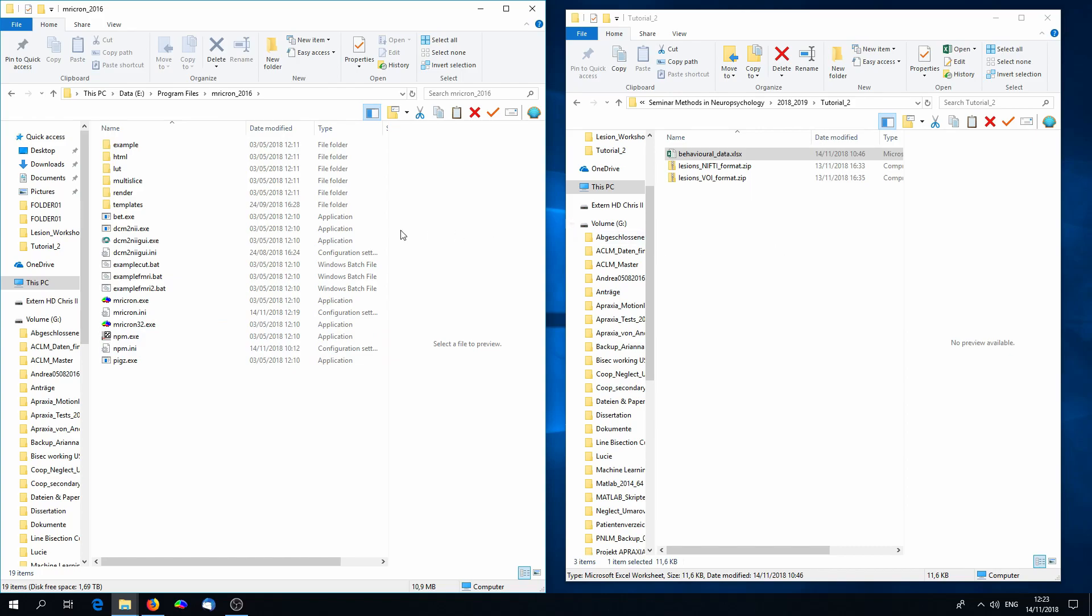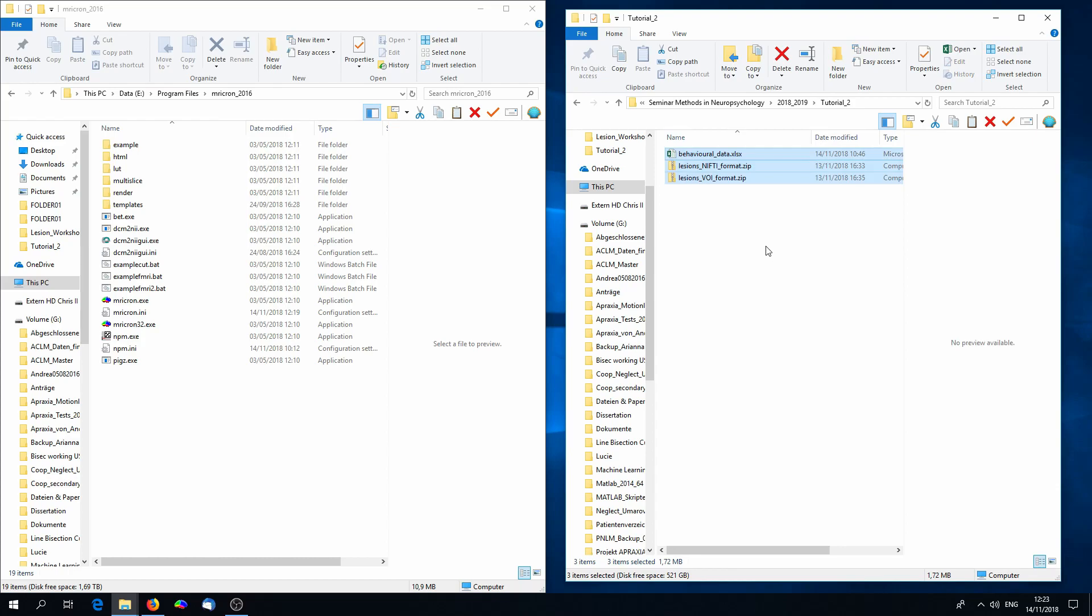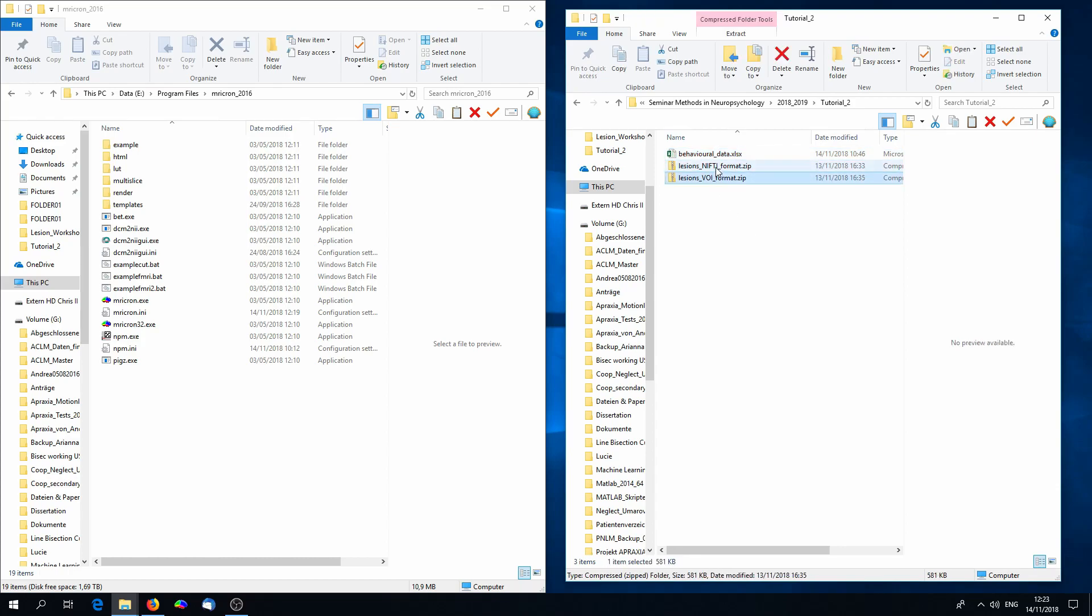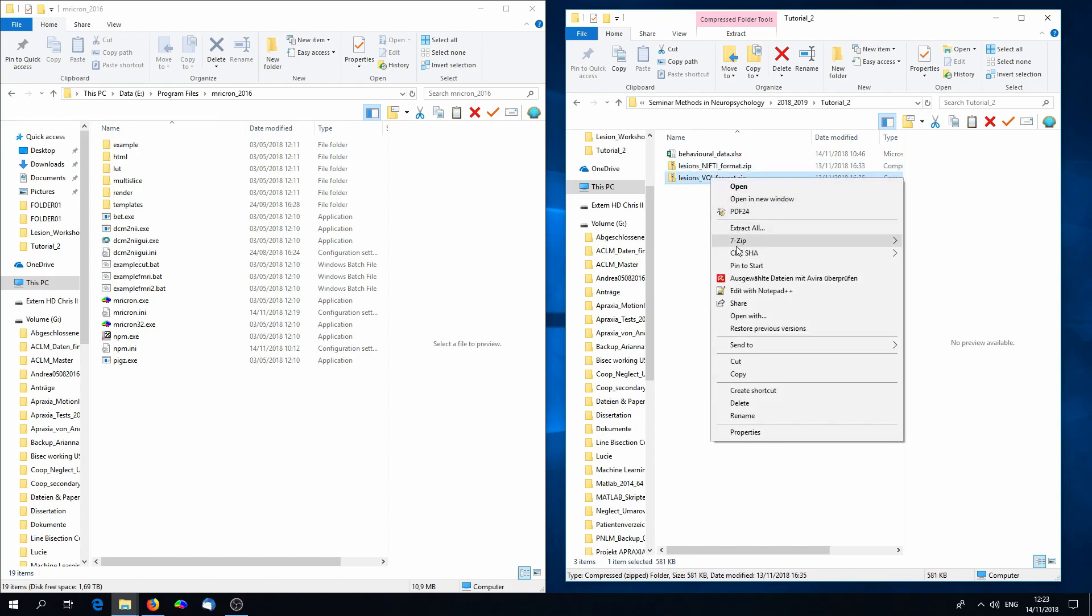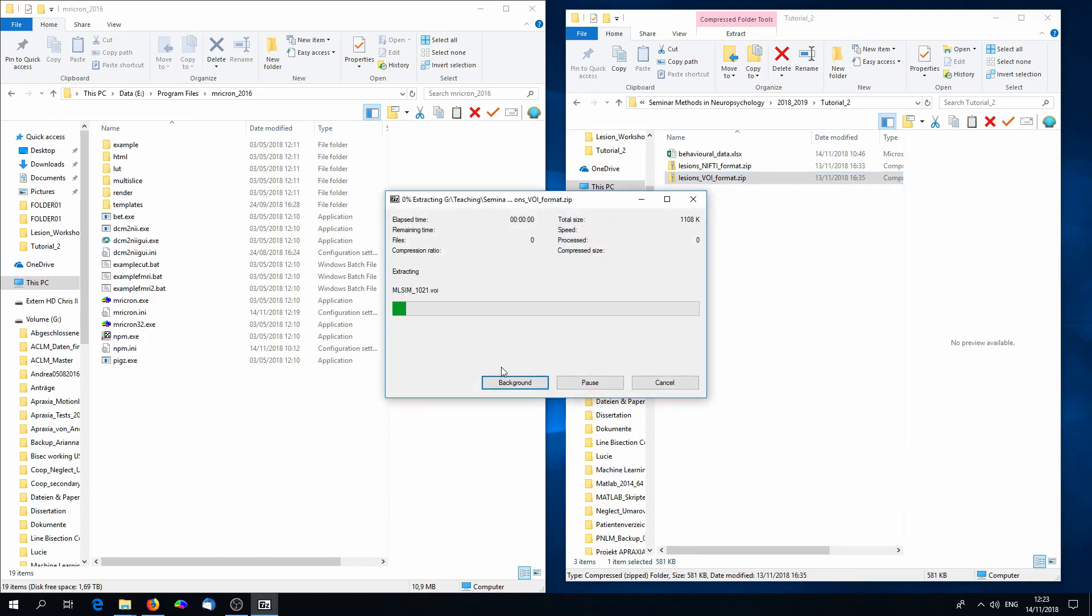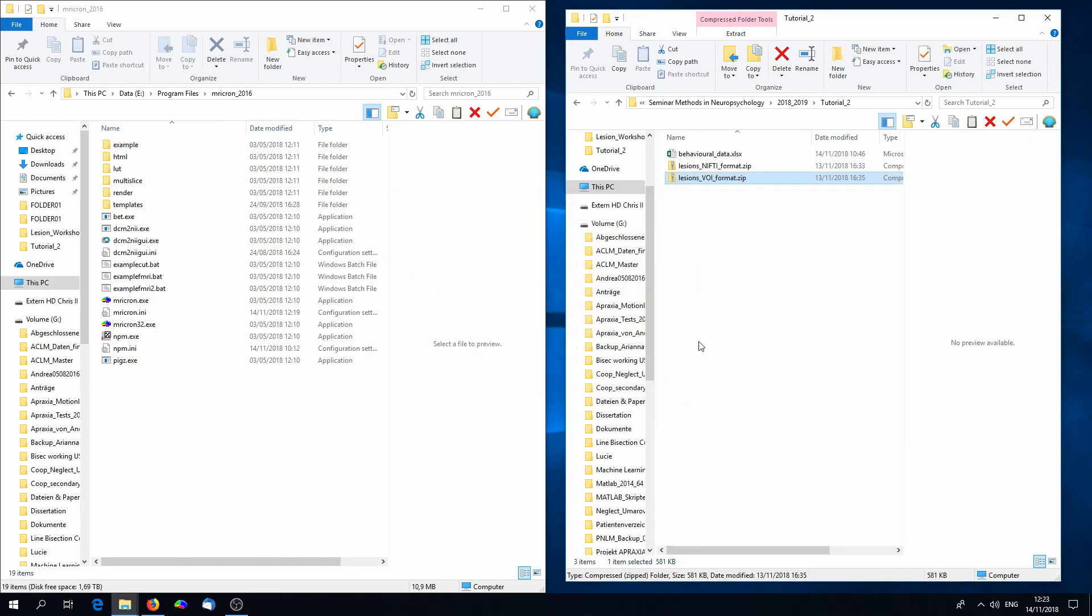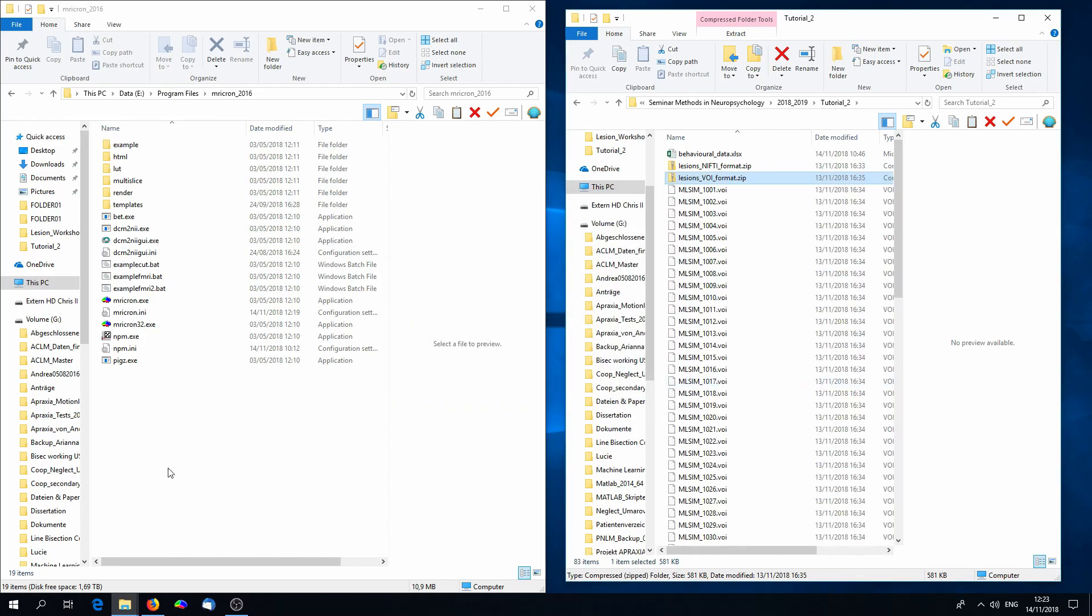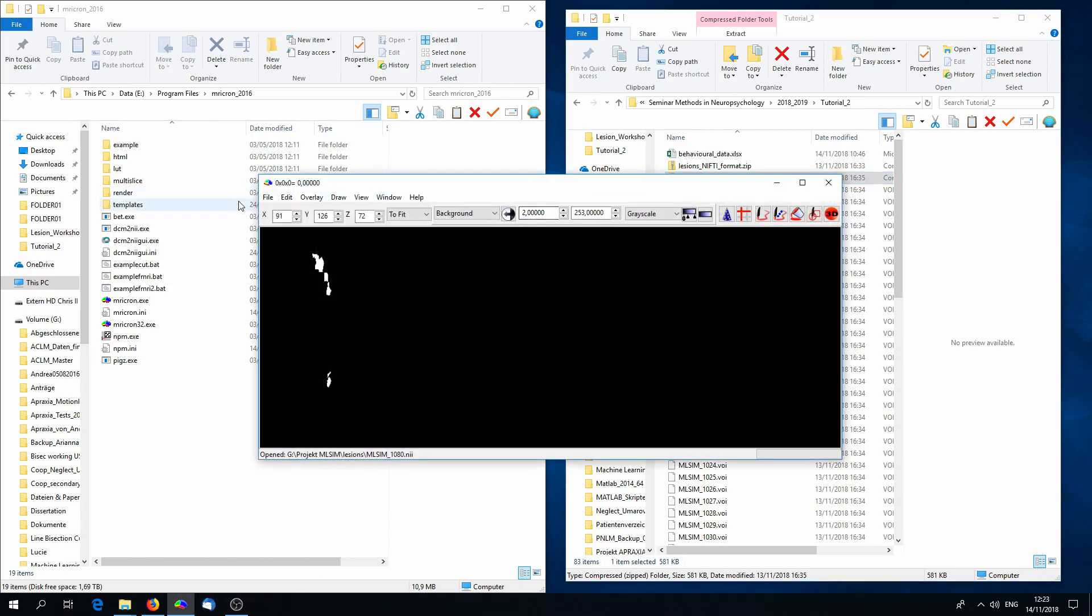Besides the software, you will need data. I provided you with some data on Ilias, and you will see that there are two kinds of lesion formats. Today we just need the VOI format, not the nifty ones. Unzip the VOI files, and you will see that there are 80 lesion images.